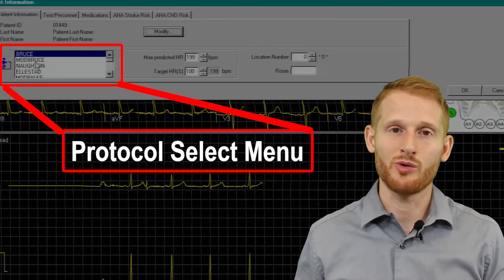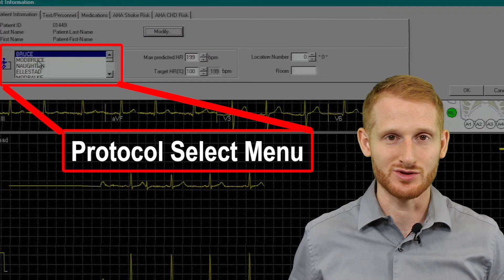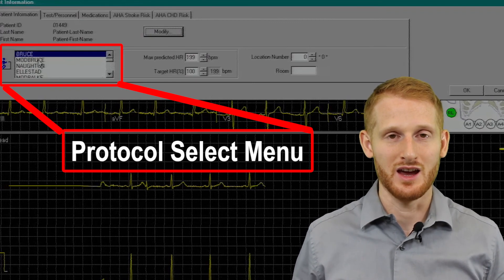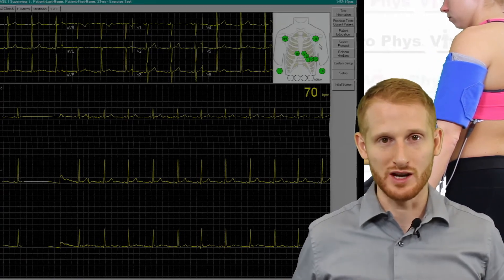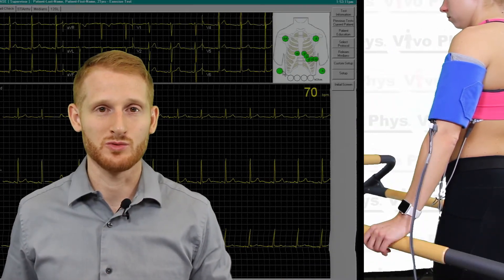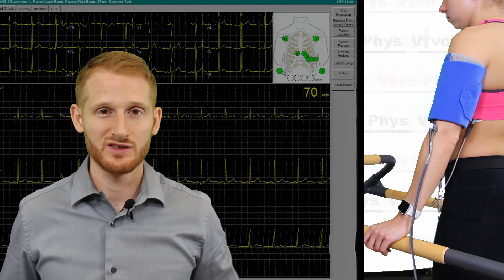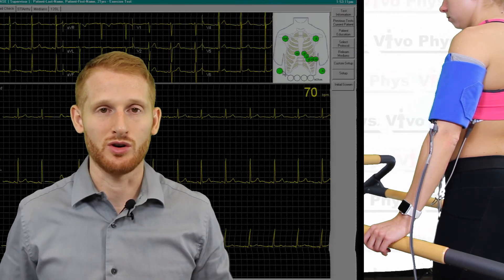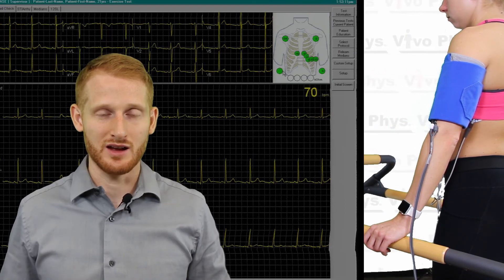You're going to select a protocol within that list. We're going to use the Bruce protocol because it's the most commonly used treadmill test in the United States. If you just have that highlighted, then you click OK, and that dialog box is going to go away. Underneath where that dialog box was, there's a little diagram of the torso of an individual with circles where all the electrodes would go with the names of those electrodes.